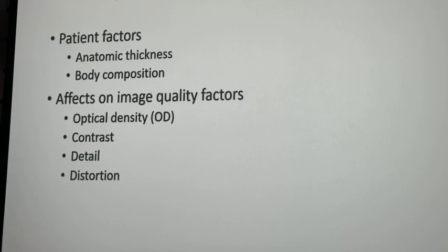You can't have too much, and we'll take a look at some x-rays here in a minute and see where we've got too much density. Contrast. So we have to have contrast. Contrast is controlled fundamentally by differential absorption inside of the patient. If you have no difference in absorption in tissue types, then you have no contrast, right? So in the x-ray beam itself and in the remnant beam, that differential absorption is what gives you your contrast.